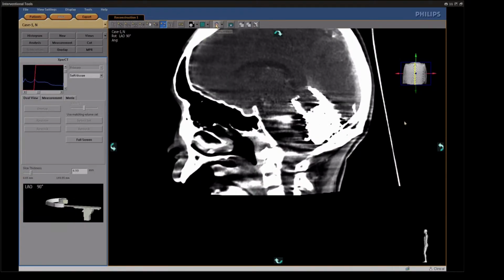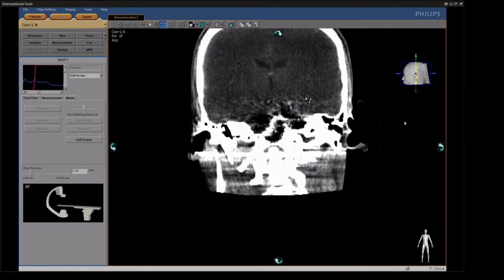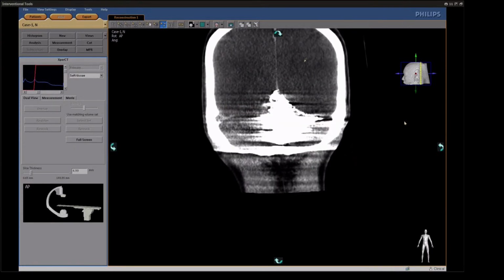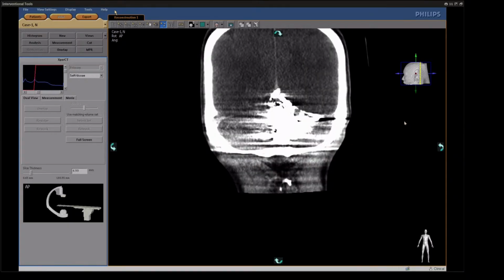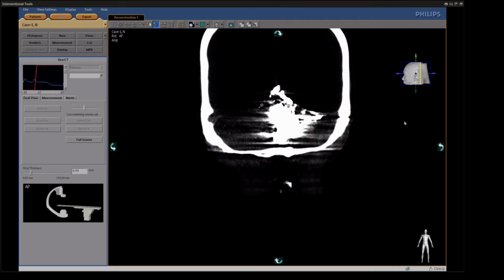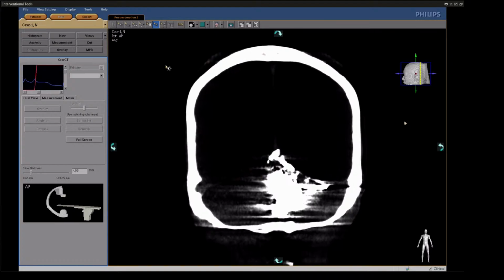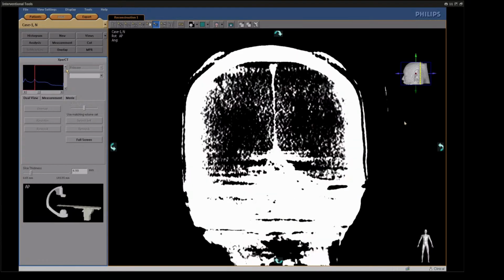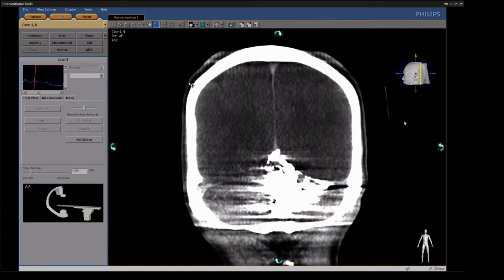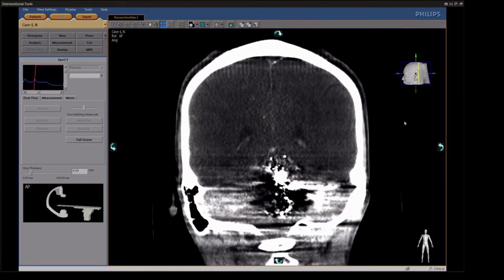And now you can see the lateral ventricle is symmetrical, the third ventricle is okay, and a cast of liquid embolic here. We may play with this, and may play with this. Okay. I hope everything is okay, and we can finish the case.